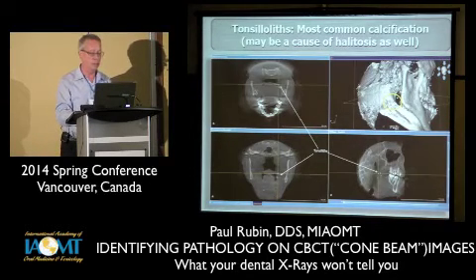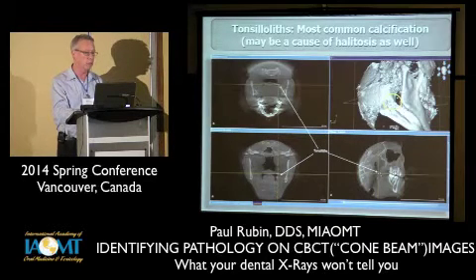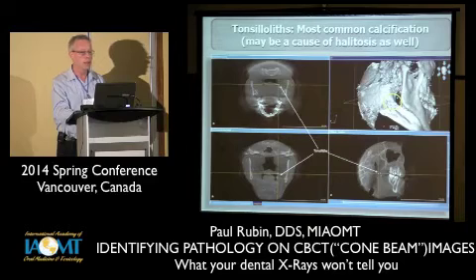Tonsilloliths are apparently fairly common, and you'll see them on an image, and you can tell where they are, so you know it's in the tonsils.